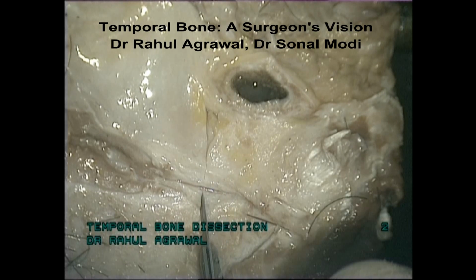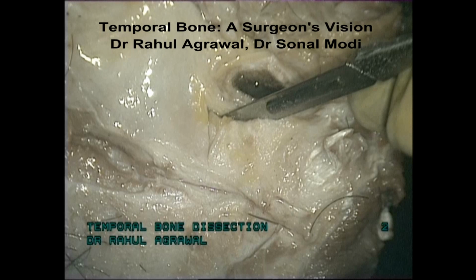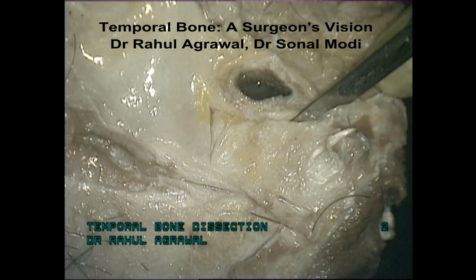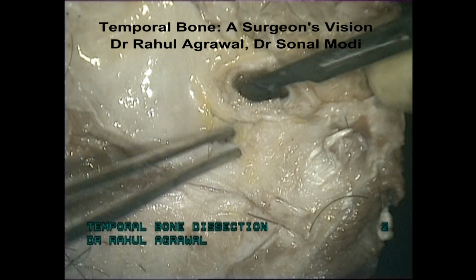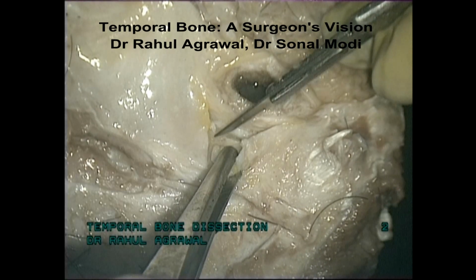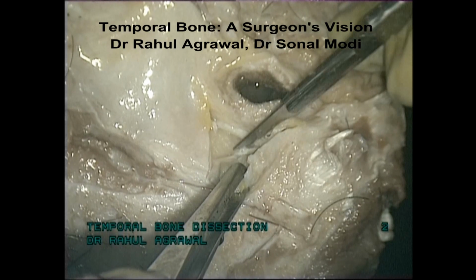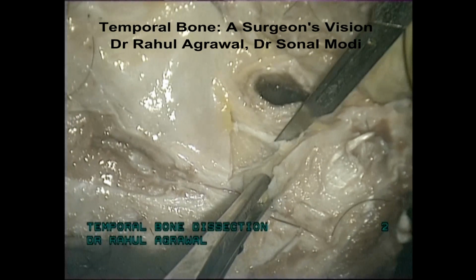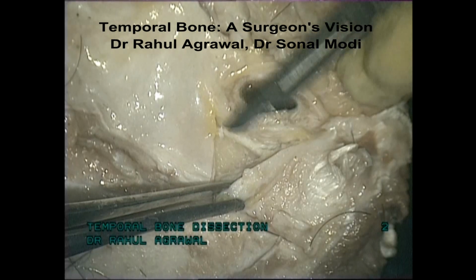Our first musculoperiosteal incisions are the same as for cortical mastoidectomy. One incision is along the posterior superior canal wall. Another incision is along the temporal line. Hence we elevate a triangular shaped musculoperiosteal flap exposing the cortical mastoid.